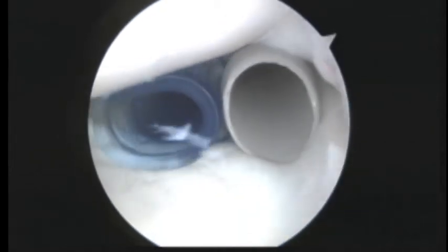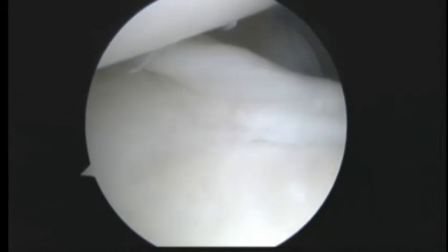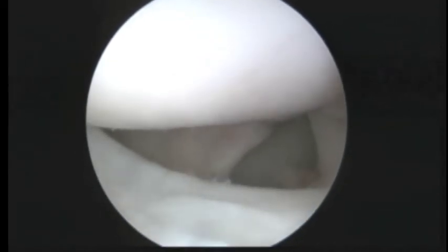So now we're looking from the back to the front again. Rotate me down to 9 o'clock, please. And as we look down the front, first of all, it's hard to see down the back, which is good. That's what we want. In the front, you can just see that stitch that we put in. And then here, this tendon here is called the subscapularis, and that looks fine. I don't think there's anything else we need to worry about. It looks like that labrum's back where it needs to be.